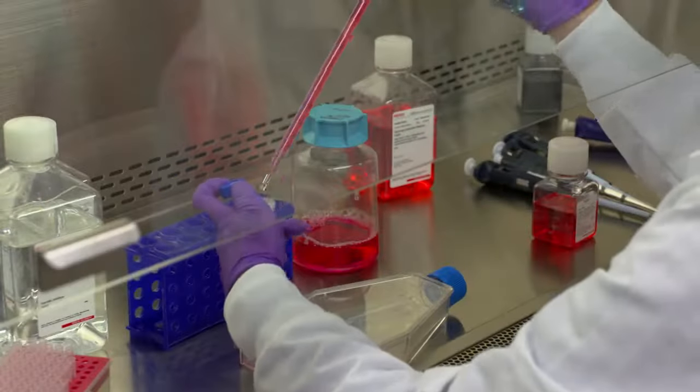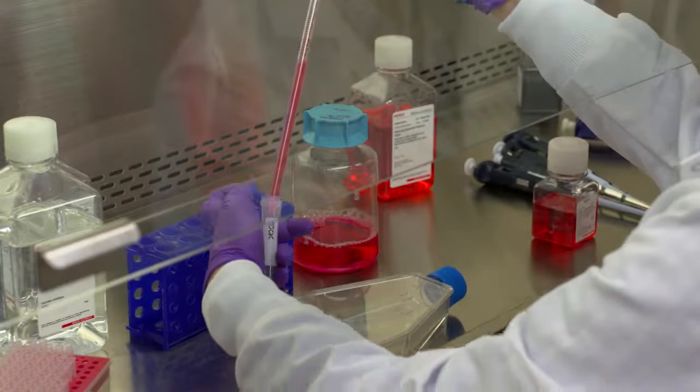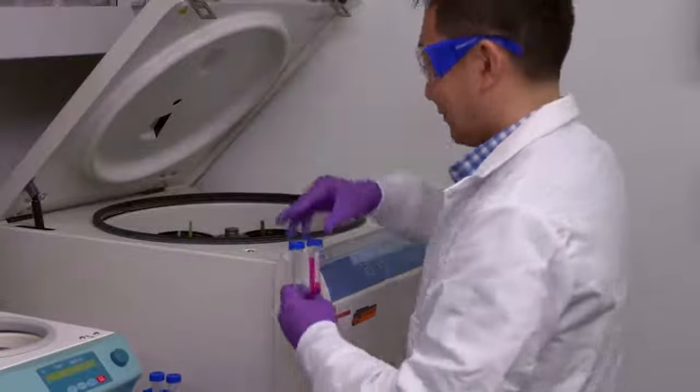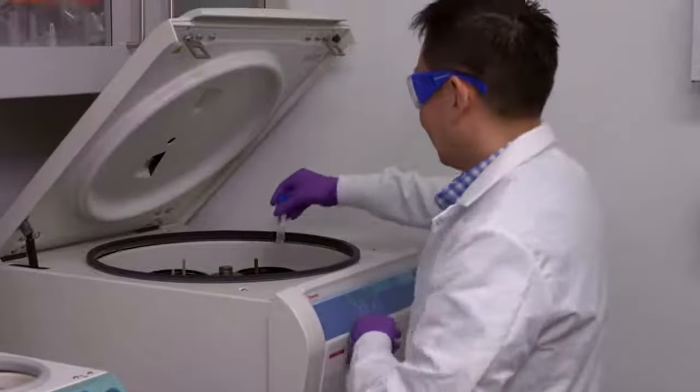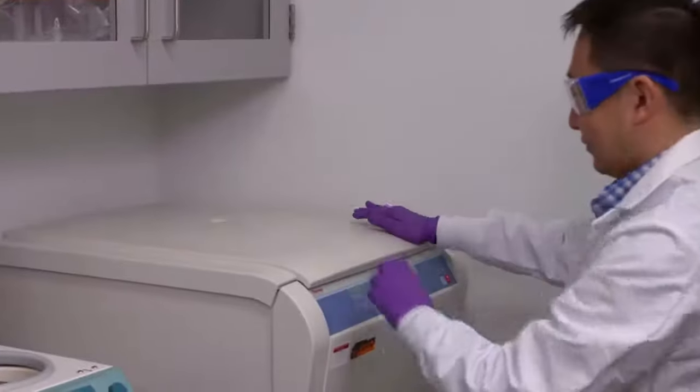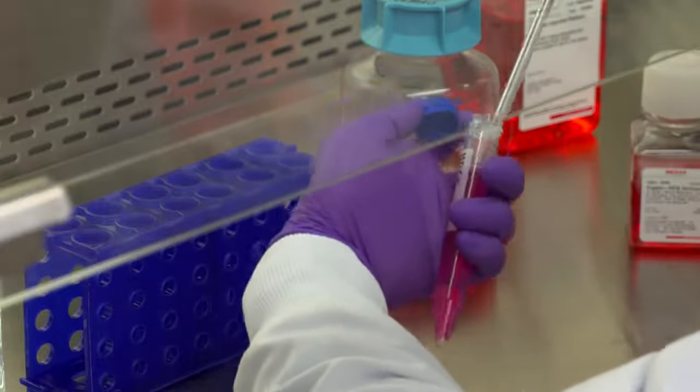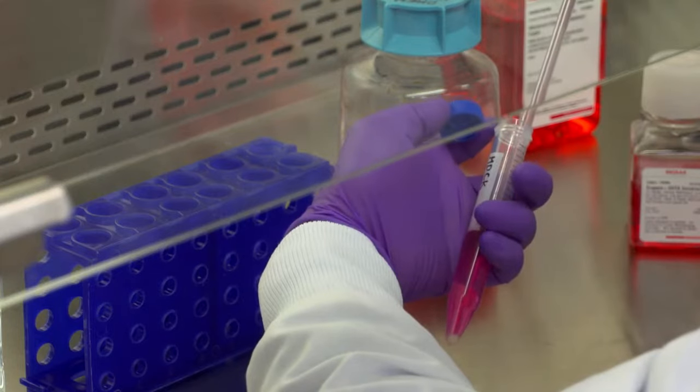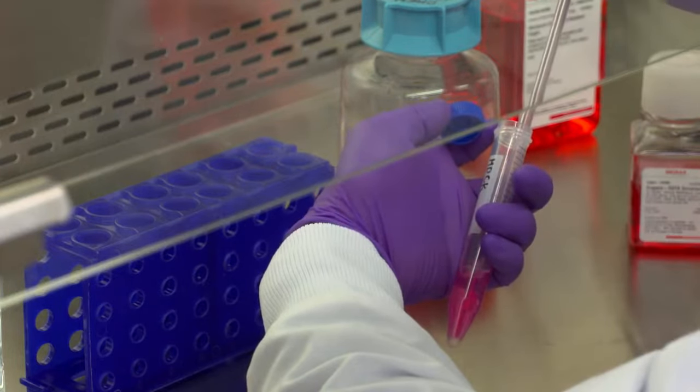Transfer cell suspension to a conical tube and centrifuge for 3 minutes at 300g. Centrifugation condition will vary for different cell types. Discard the supernatant and gently resuspend cell pellet to a suitable volume for counting.